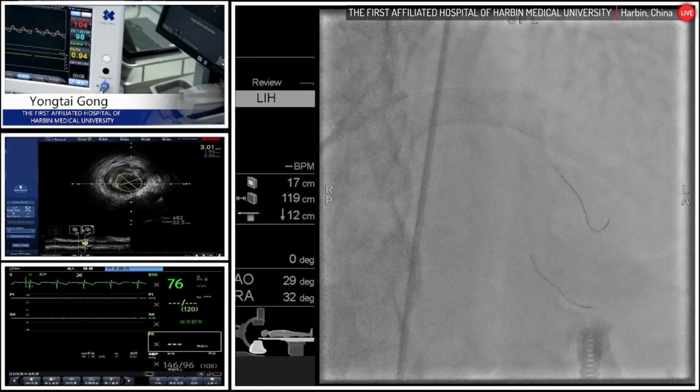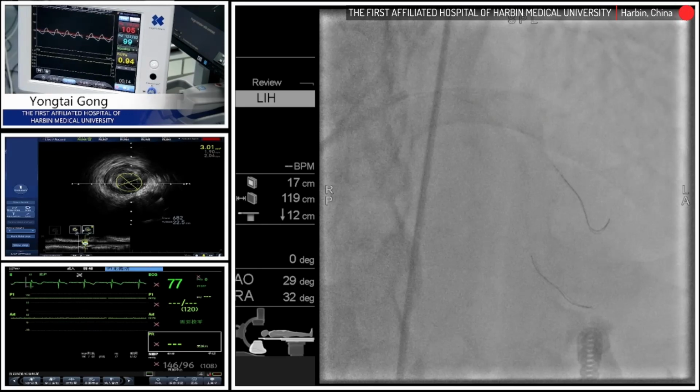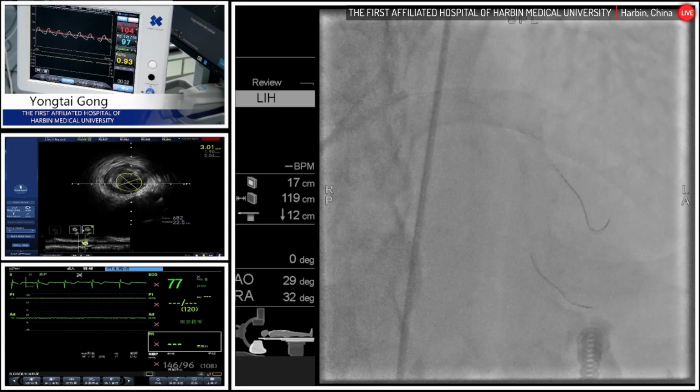According to the intravascular imaging, like IVUS, we have multiple minimum lumen area cutoff values to predict ischemia for clinical usage. However, there is no one cutoff value that is agreed by all the experts, and we make consensus on this one because a different vessel has a different area of myocardial perfusion.